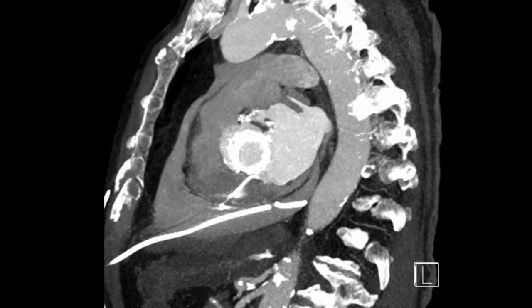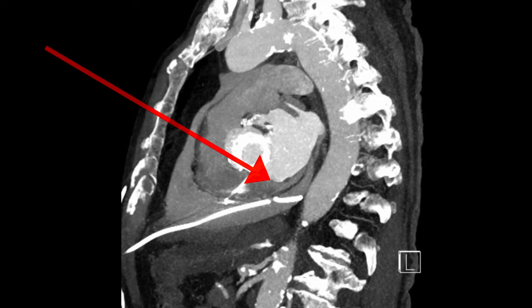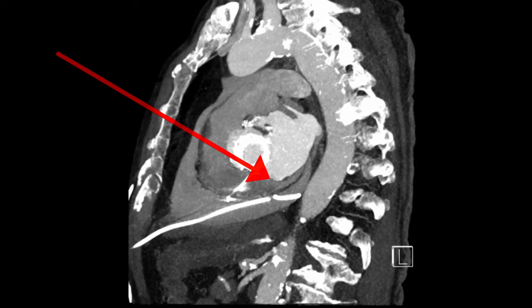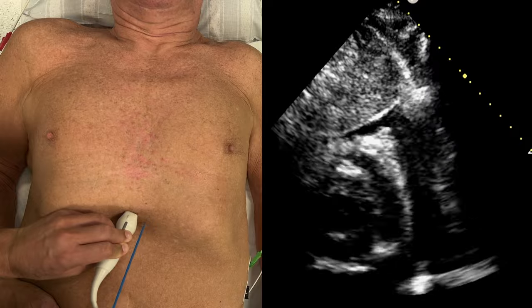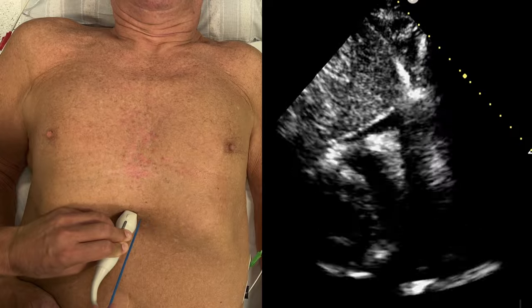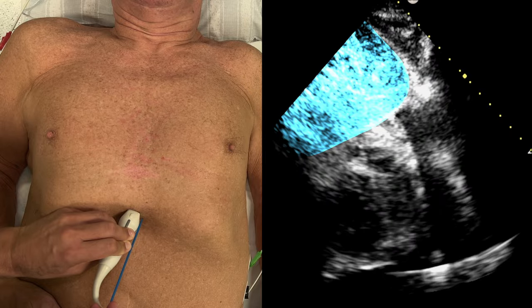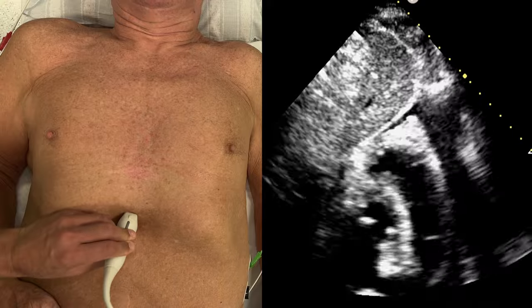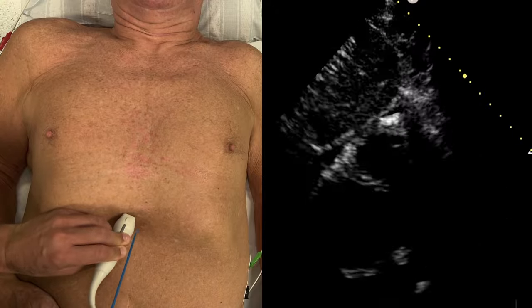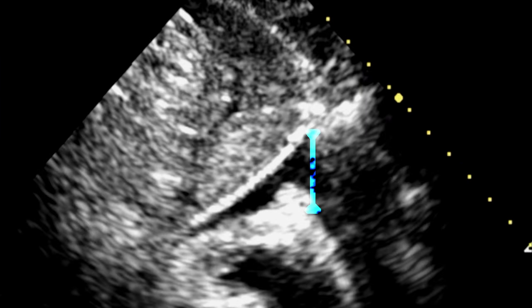But if done properly, the pigtail should end up with the tip in this dorsal location. This is the sub-xiphoid ultrasound view of our patient. The ultrasound fan is vertical in this image, and the left side of the image is caudal, where you can see the liver, and the right is cephalad, where we would puncture, where you can see the approach towards the pericardial fluid. Note the small distance from the fluid to the right ventricle.